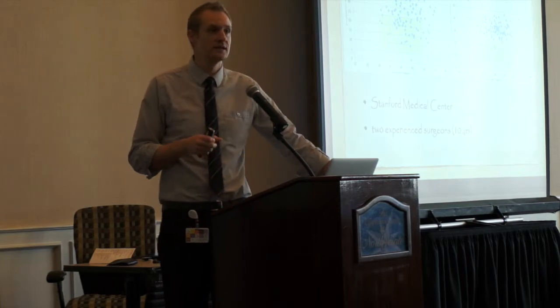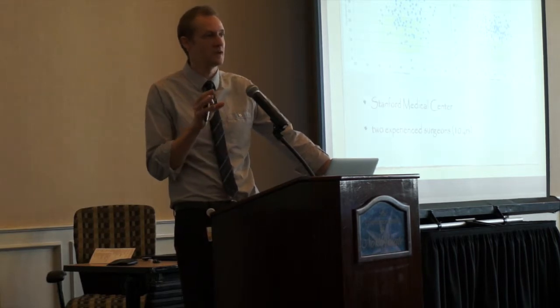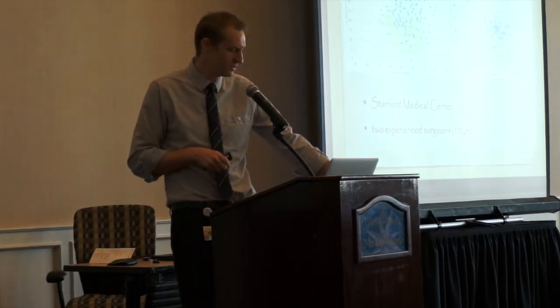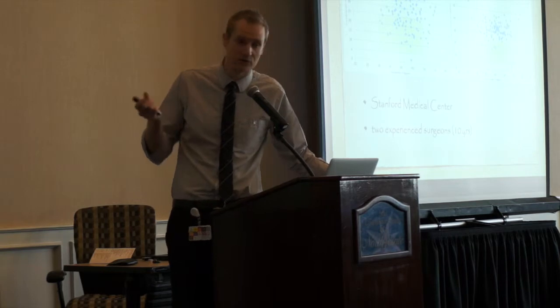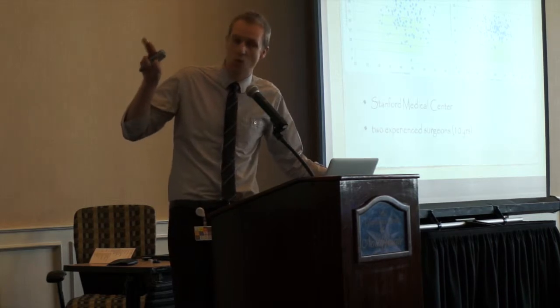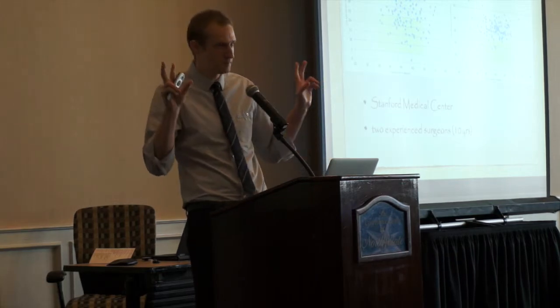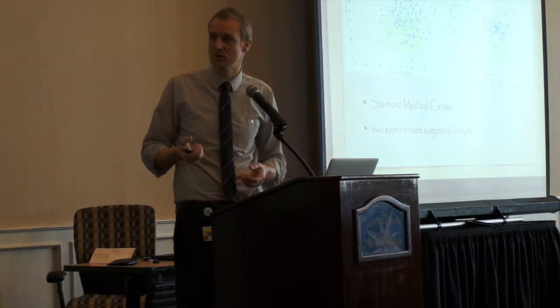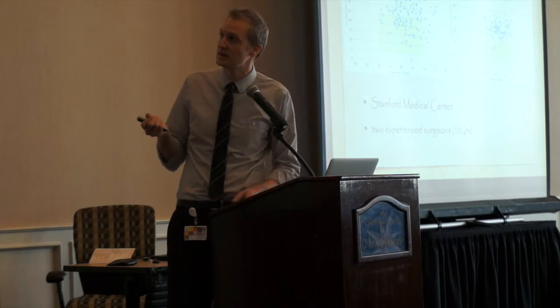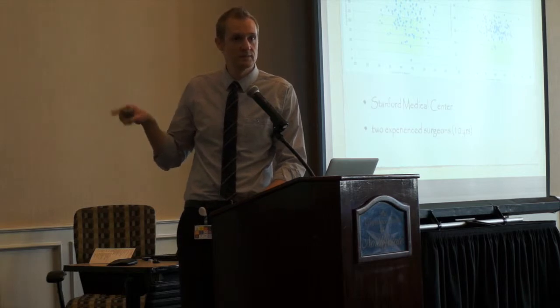Post-operative x-rays were looked at for angles and different positions of the implants that we look at to say whether or not the components are positioned correctly and whether or not that's going to decrease a dislocation rate. So this graph, essentially what you should focus on here is the green box. There's two different angles, the X and Y axes of the graph here. You want data points to fall in that green box, which would say the cup is positioned perfectly to try to decrease dislocation and complication rates. So 100 patients in both groups, you can see that about 50% in the anterior approach fall perfectly in this box, 5% in the posterior approach.